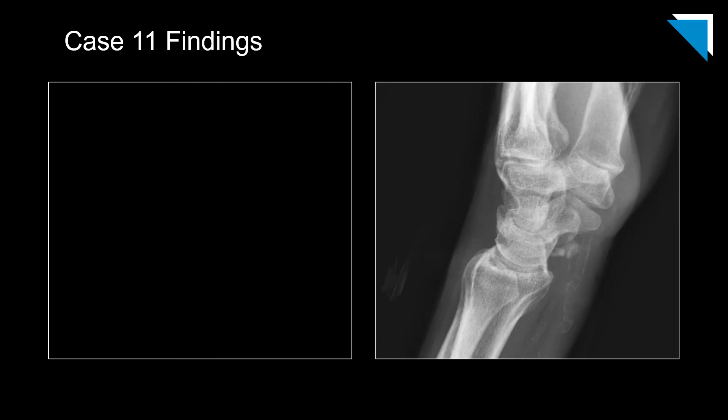Our next case is a 60-year-old man with pain. This is a lateral plain radiograph of the wrist demonstrating scattered degenerative changes and dense vascular calcifications, but also some amorphous radio-opacities along the volar aspect of the wrist just proximal to the pisiform. This is consistent with hydroxyapatite deposition.